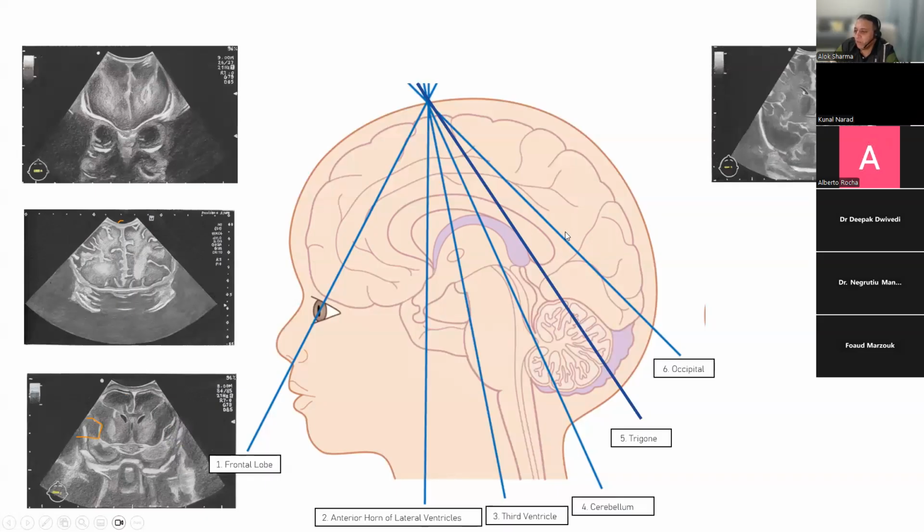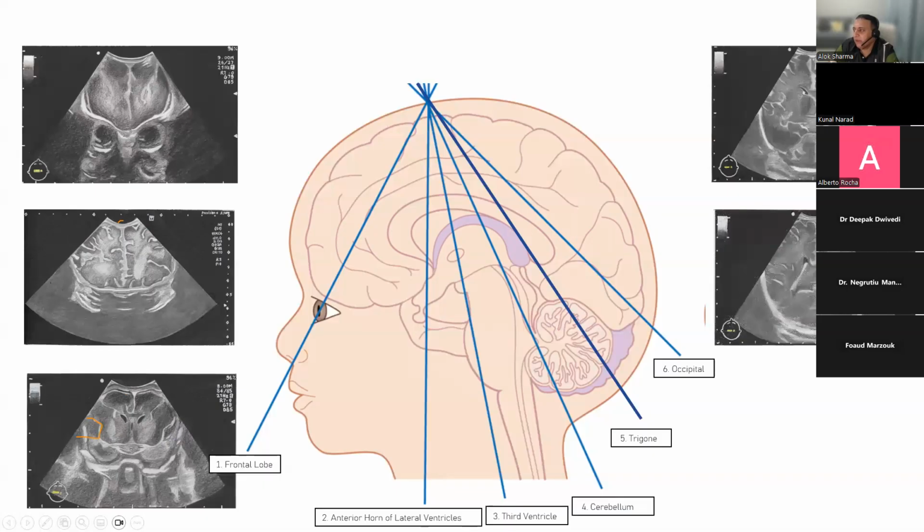And then what you're seeing once you go further back is the lateral ventricles, again, the Sylvian fissure with a Y. You may or may not see the cavum septum pellucidum in a term baby. It may have disappeared by this particular point. This view is also sometimes called the trident view, because if you see the cavum septum pellucidum in the middle, then what you basically see, and in a term baby you may not see it because it might have disappeared, is what is called a trident. Aquaman's trident. For those of you who come from India, the goddess Shiva has what we call a trishul. It's like a trident with which he slayed a lot of demons. So it's basically called the trident view.